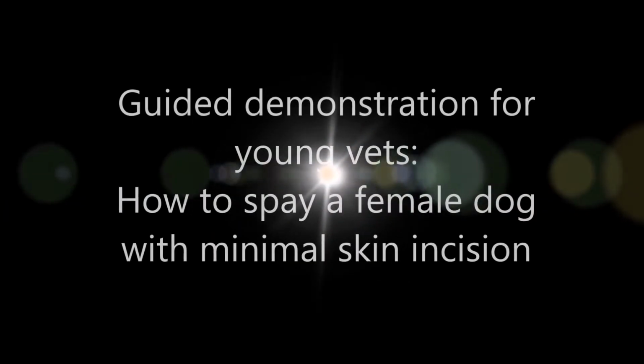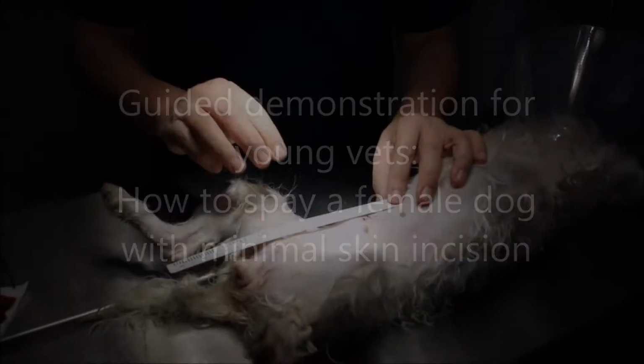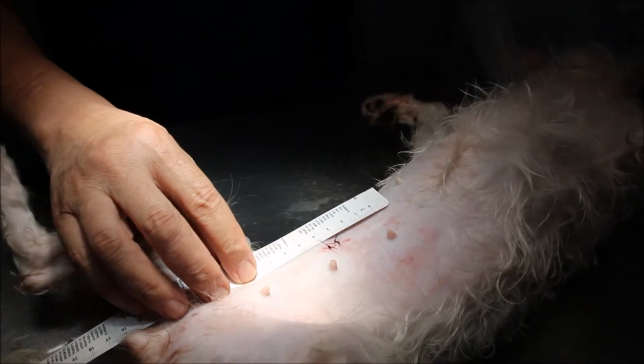Today, Dr. Singh will be doing a guided demonstration for young vets on how to spay a female dog with minimal skin incision. Our patient today is a 10-month-old female Maltese crossbreed.